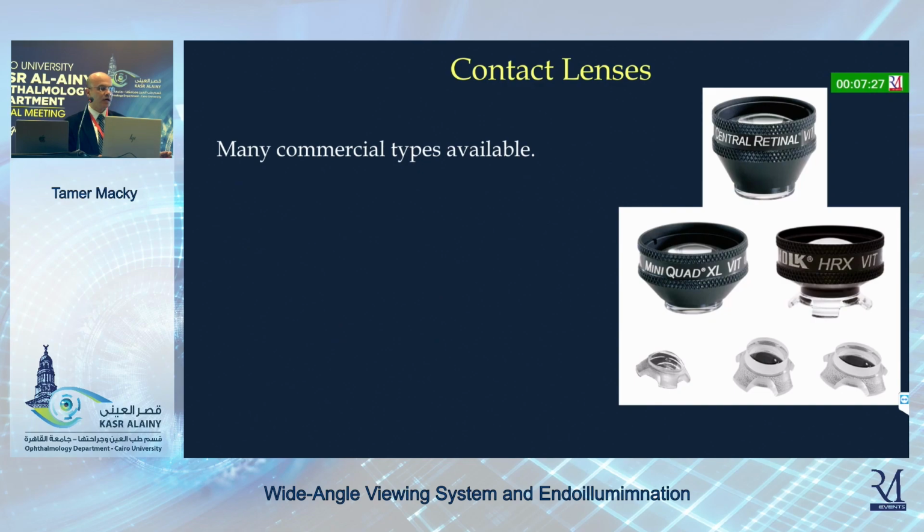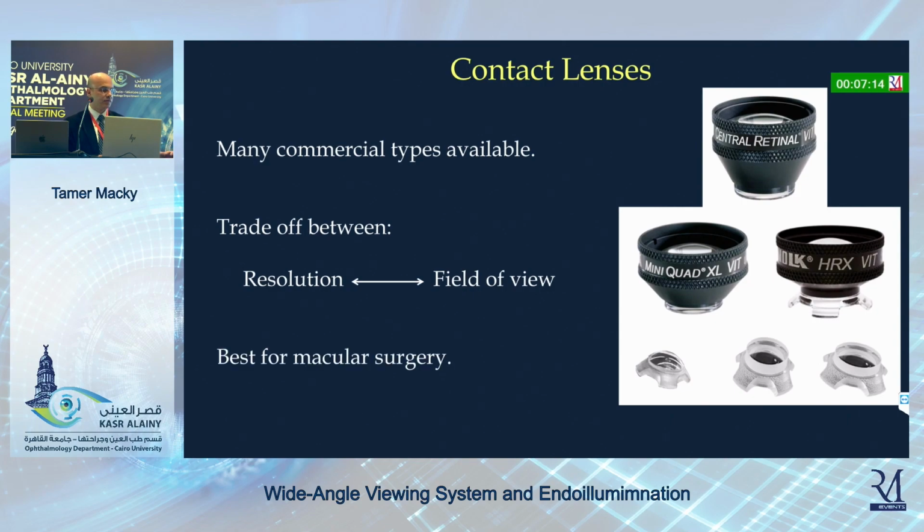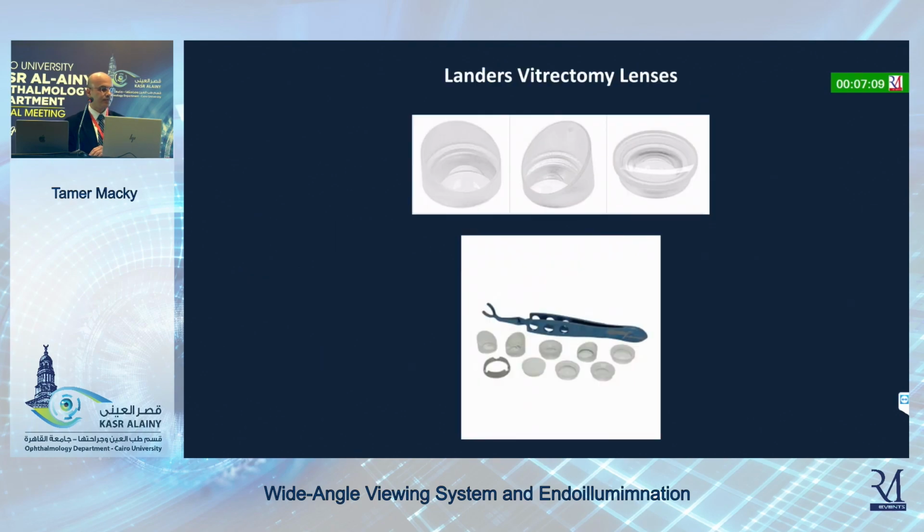Many commercial types are available, and when we buy one, we should make sure that we take care of the trade-off between the resolution and the field of view. The higher the resolution, the smaller the field of view, and vice versa. And that's why this type of lens is best used for macular surgery.